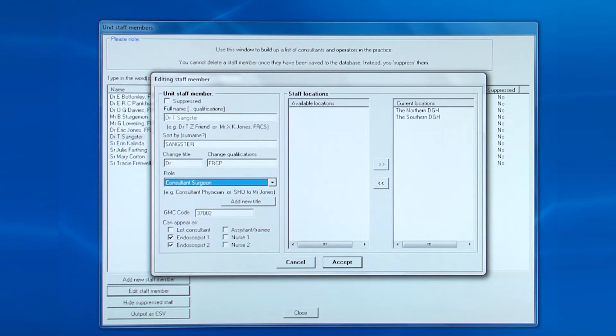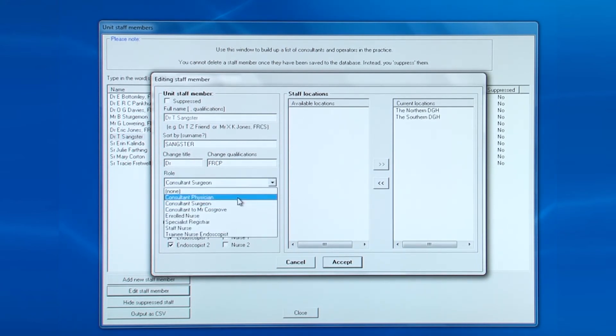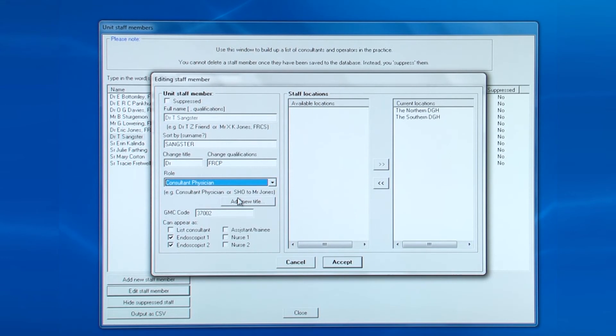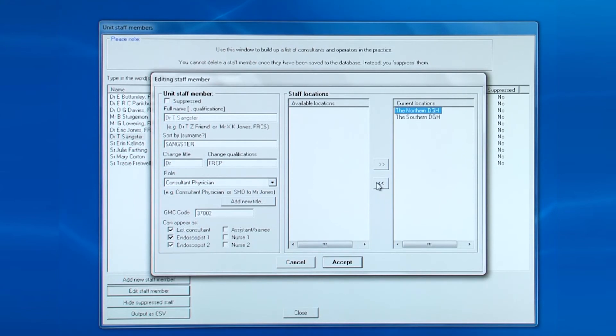You can add his qualifications, change his role, add him now as a list consultant, and remove one of the current locations. Then click accept.